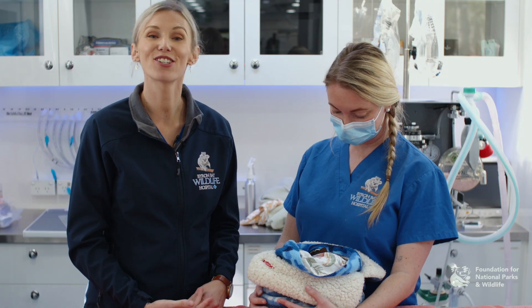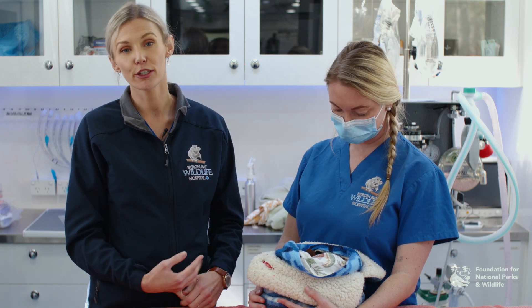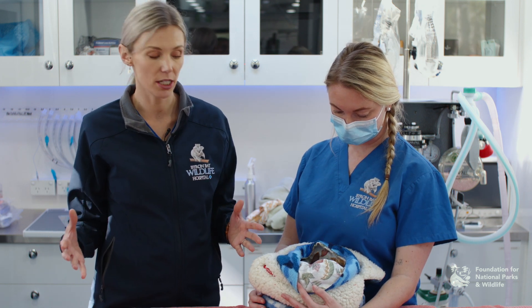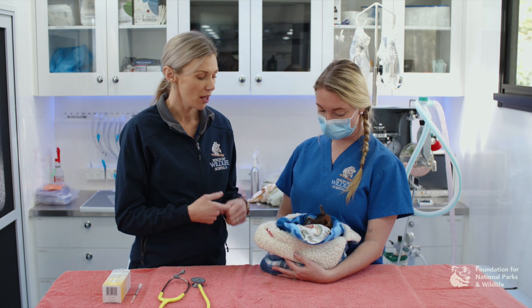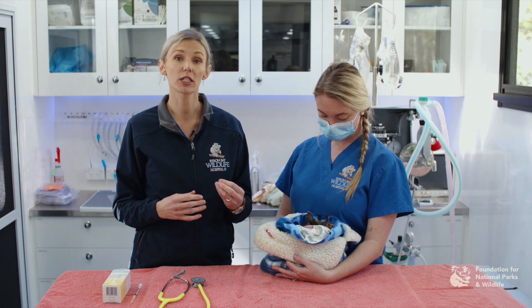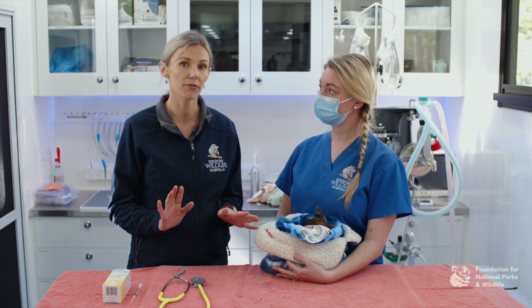What we're going to do now is show you where you can take blood, where you can give fluids, and the veins that you can use for euthanasia. Now these are the same for most of your domestic animals and most of your mammal species. These places are going to be your external jugular vein, your cephalic vein, your tail vein, and your medial metatarsal vein. These are going to be in the same spots as your dogs and cats, but they're going to be a lot smaller and they can collapse when you do put pressure on them, so be mindful of that.